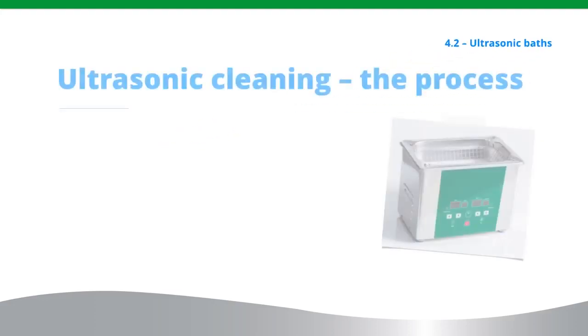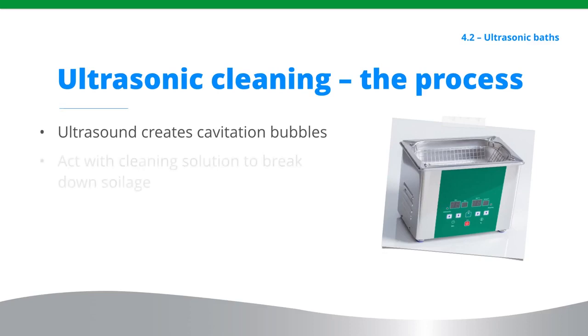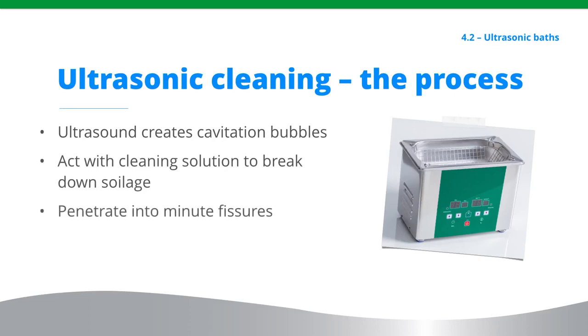Ultrasonic cleaning is a process that uses ultrasound to create minuscule cavitation bubbles in a container of cleaning solution. These produce high forces on soilage particles lodged to the surface and inside channels of an instrument. These soilages are more effectively broken down by the combination of cavitation and the chemical activity of the cleaning solution. Minute fissures and recesses are penetrated by the process in a manner that cannot be replicated by simply soaking in an immersion tank. Cleaning will typically take between 10 and 30 minutes, dependent on load and perceived soilage.